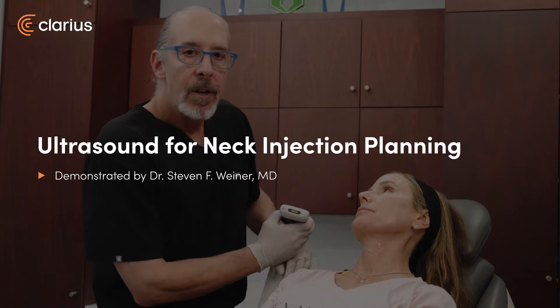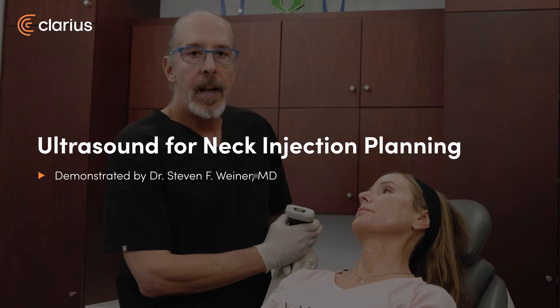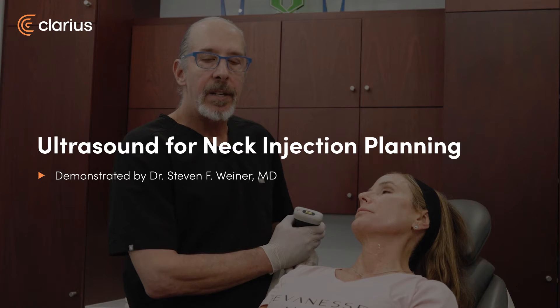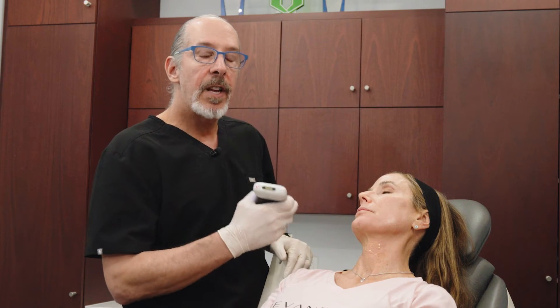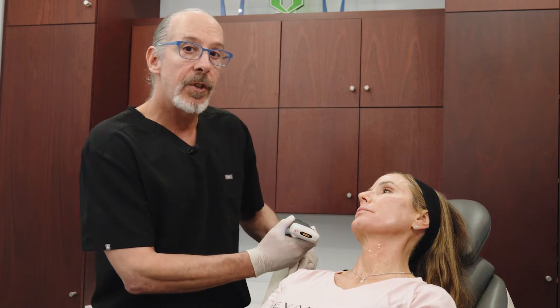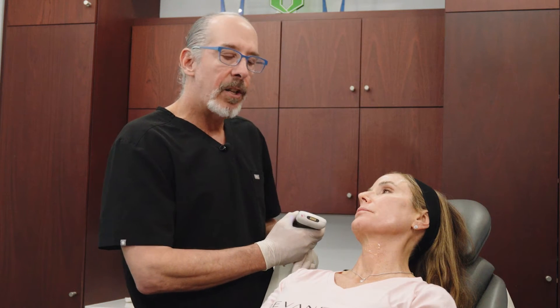Let's look at the neck now. Really, the only area of interest in aesthetics is that superficial layer. You're going to have the skin, you're going to have subcutaneous fat, you're going to have platysma. The injections in the neck you want to be superficial to the platysma.